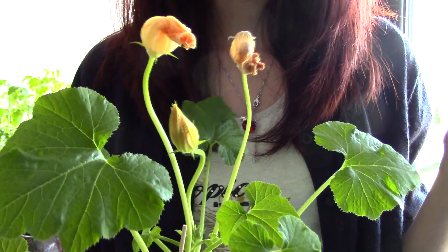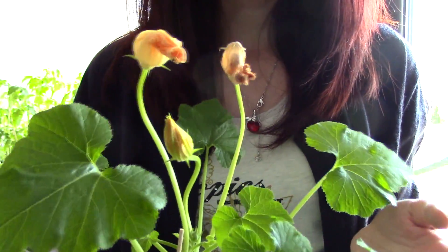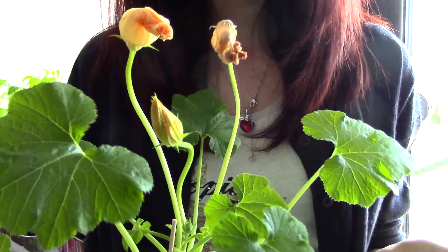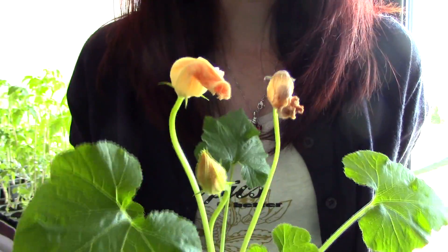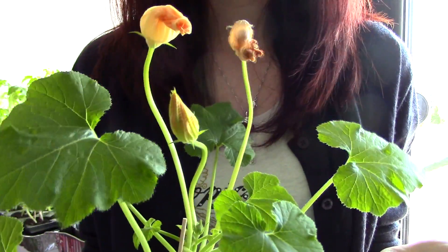Today I'm going to be using the Agdia immunostrips. These are very easy-to-use tests. You can perform a test in your home and it only takes a few minutes, and you will have a fast answer if somehow you have a plant which displays some curious or bizarre signs.